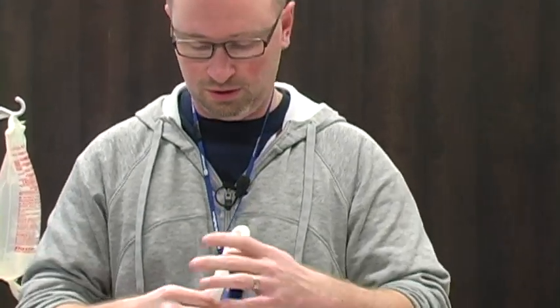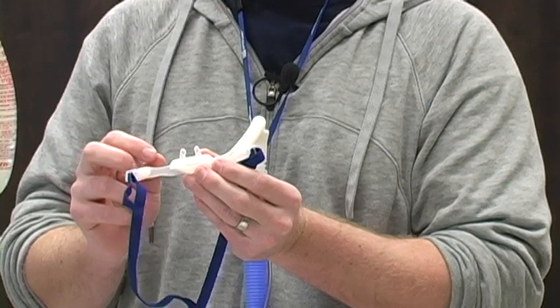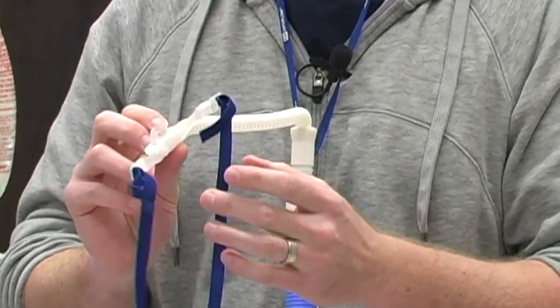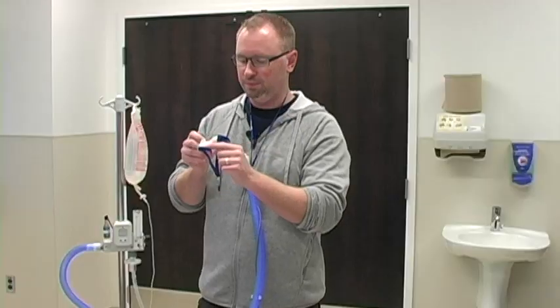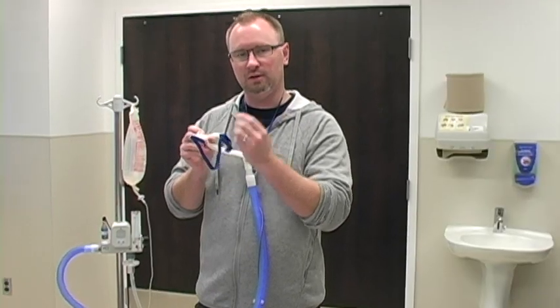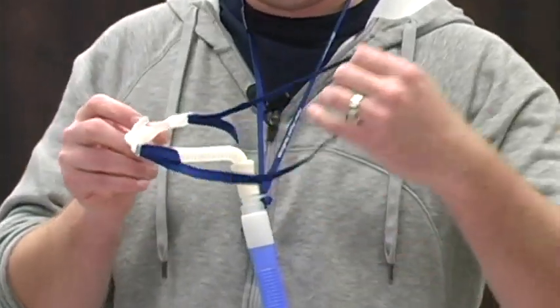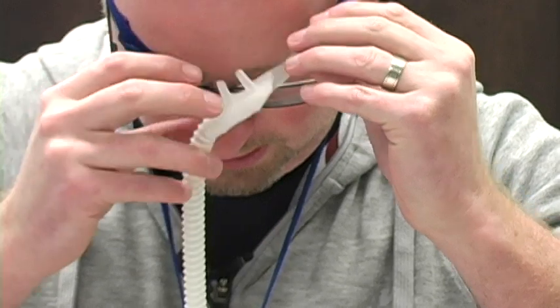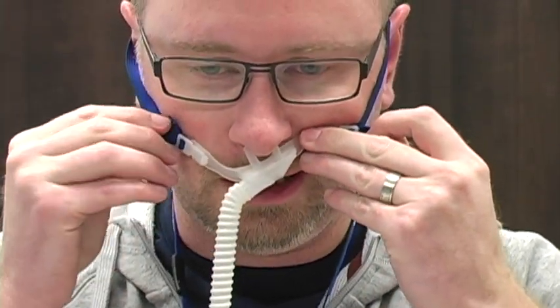And then the prongs themselves, I don't know if you can see them from there, but they're very, very soft and malleable. And this is all soft too, so you don't really get any big pressure on the nose themselves. This part ideally should be resting against their upper lip, and the prong should be in the middle of their nose. And you would take this second piece over their head as you would with regular nasal prongs and put them in their nose, and then just tighten up the side straps to get it to stay where you want it.